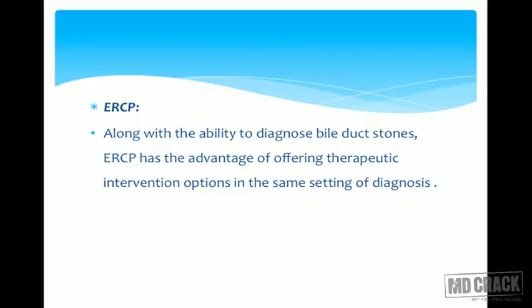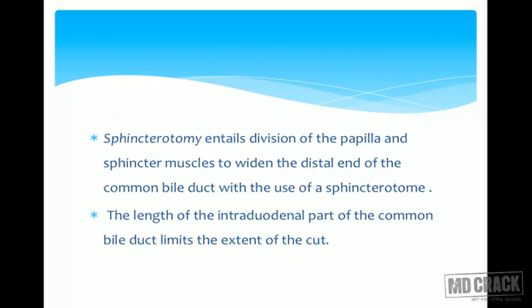ERCP is a second modality. Along with the ability to diagnose bile duct stones, ERCP has the advantage of offering therapeutic intervention in the same setting. During ERCP, sphincterotomy entails division of the papilla and sphincter muscles to widen the distal end of the common bile duct with the use of a sphincterotome.